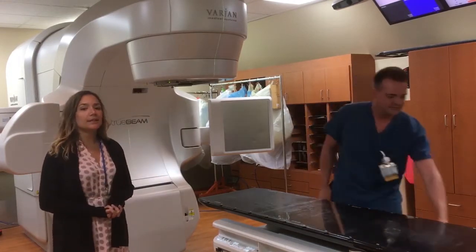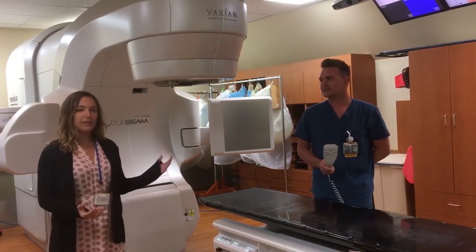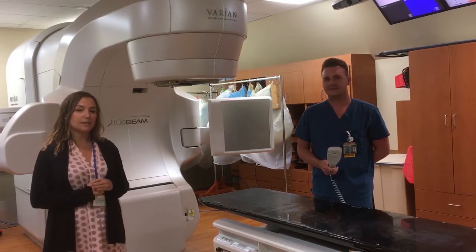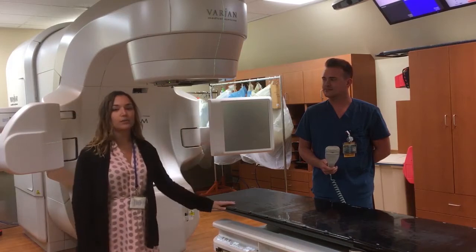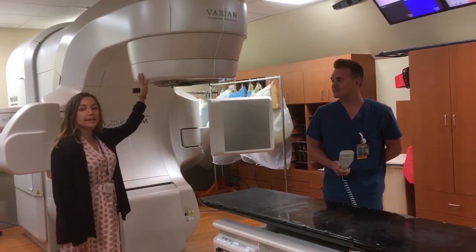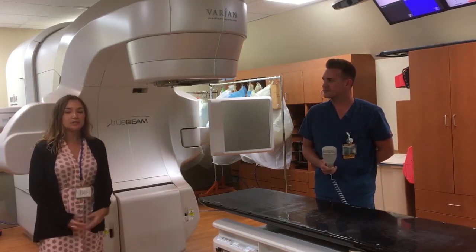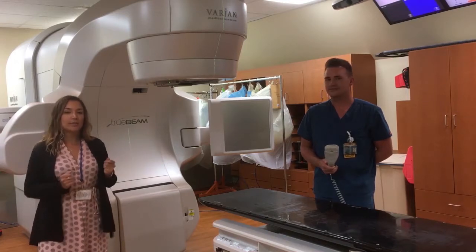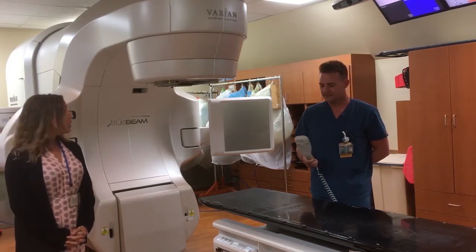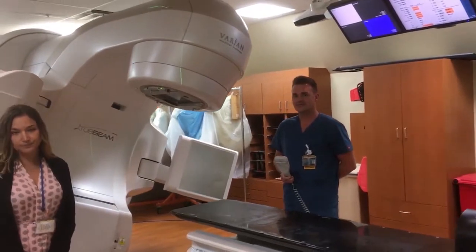Behind me is a linear accelerator. This particular one is a Varian TrueBeam. Although different linear accelerators may have a different look, they all have the same general parts. So right here we can see a treatment couch or treatment table. Up here is a gantry. This is the collimator, and on either side you can see the imaging arms. The ones that are lateral are the kV imaging arms, and the one that is below is the MV imaging panel. We will rotate the gantry to 90 so you can take a closer look at the collimator.